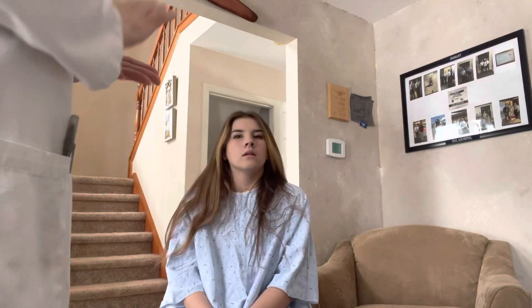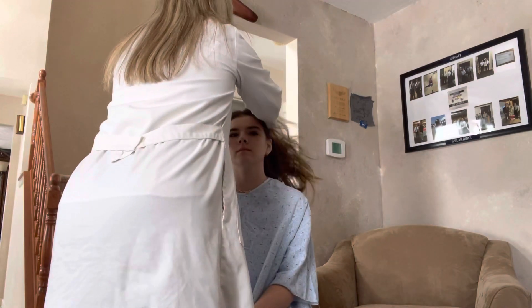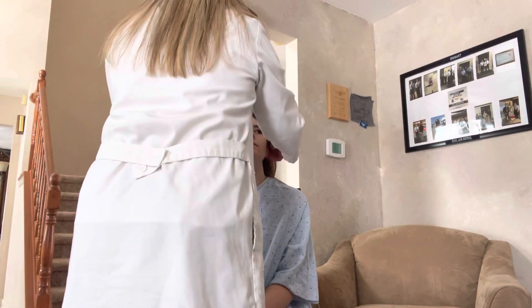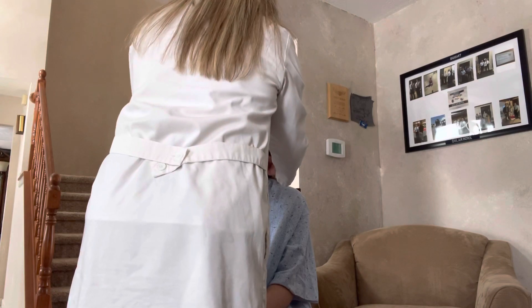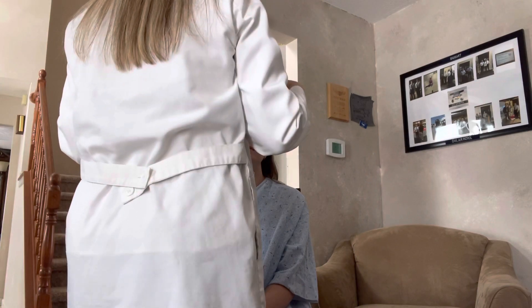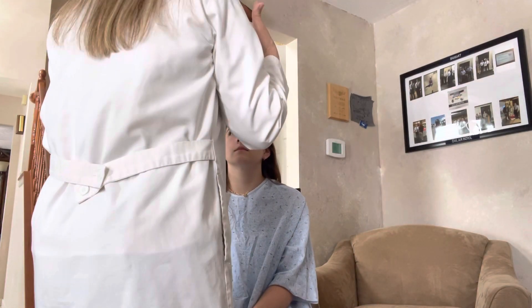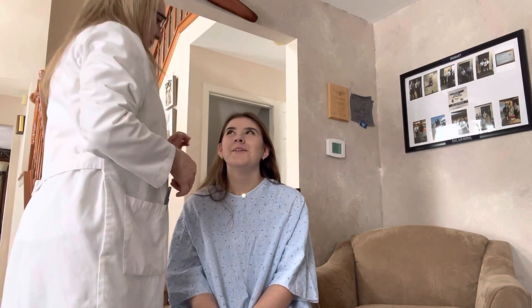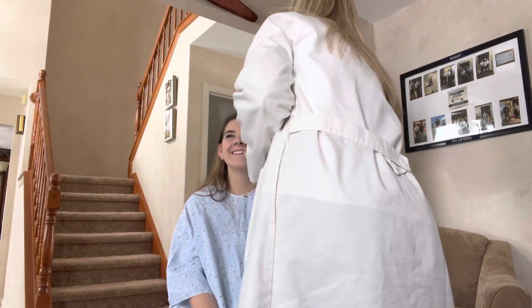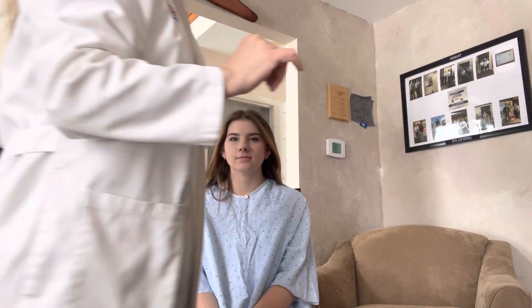The next thing I'm going to do is evaluate your ears. Have you had any earaches, any drainage from your ears, any problems? No. Okay, great. Let me remove your earrings. Next I'm going to do a whisper test — I'm going to cover one of your ears and I want you to tell me what I say. Okay, very good. Now I'm going to grab my otoscope.